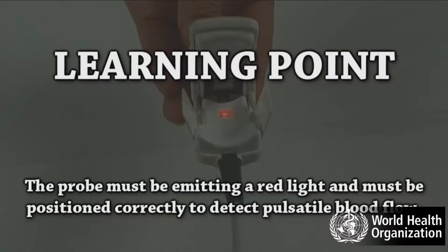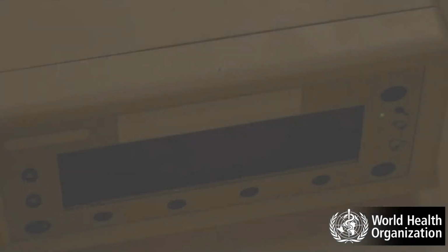Learning point. In order to get a satisfactory reading, the probe must be emitting a red light and must be correctly positioned to detect pulsatile blood flow.